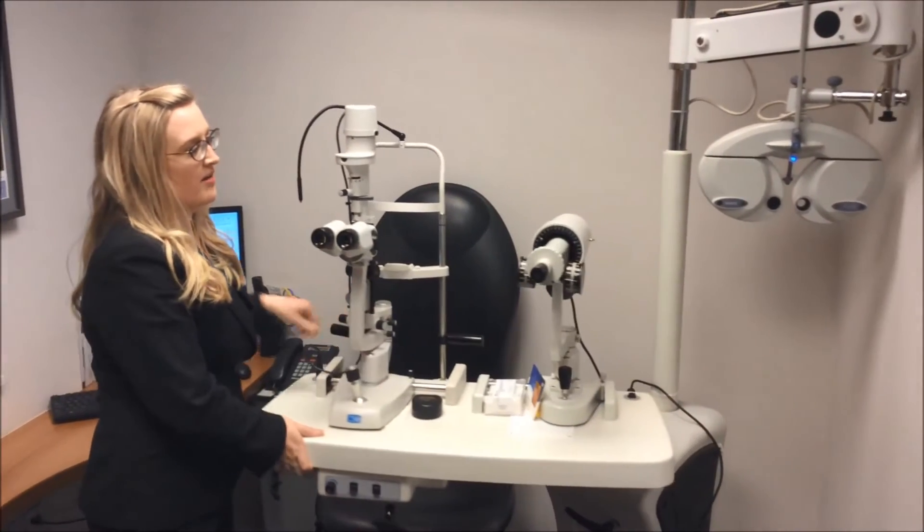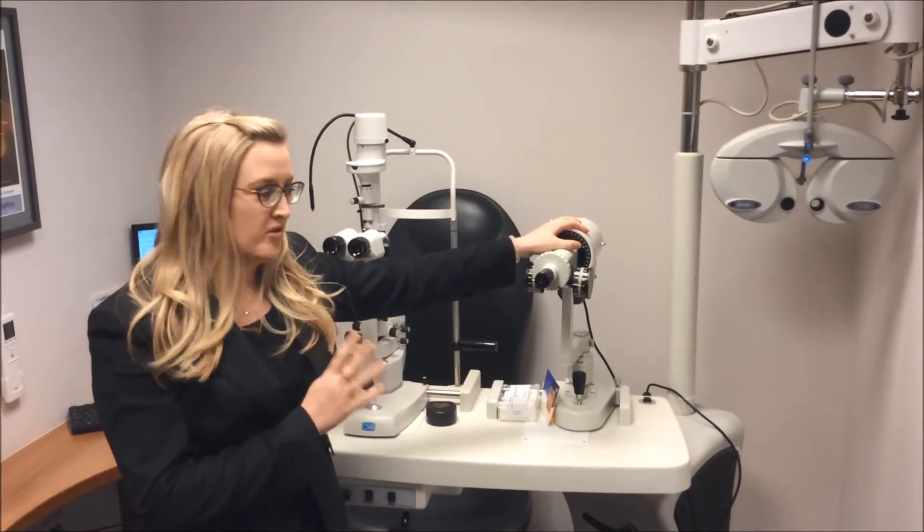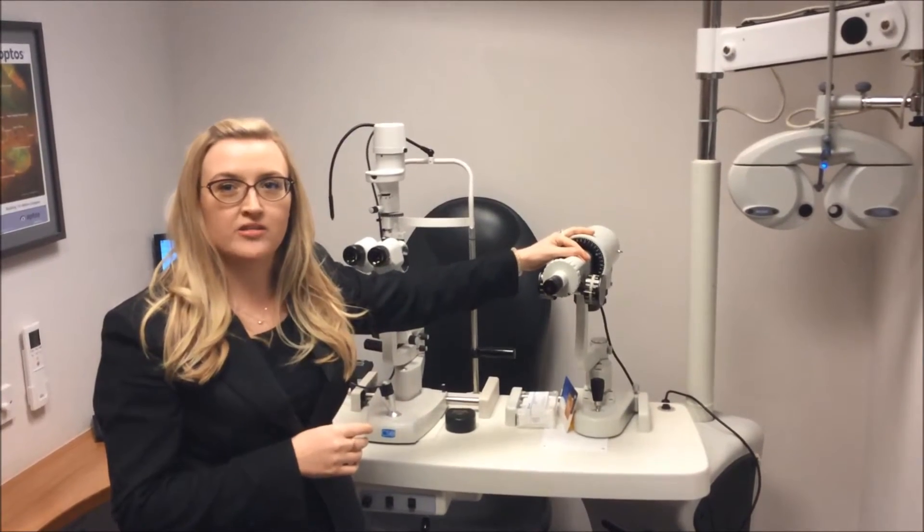And then we have this machine here which is called a keratometer. It is used when we're dealing with contact lenses, but we'll go more in detail about that in the contact lens episode.